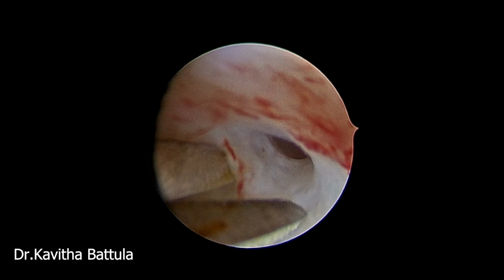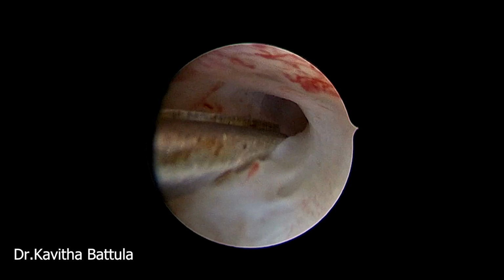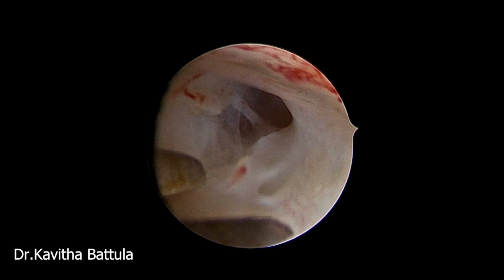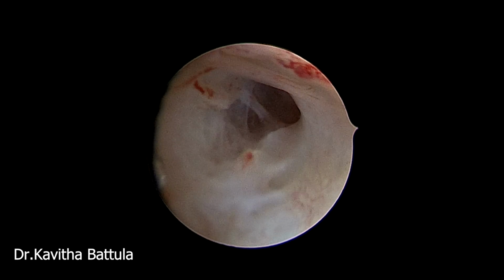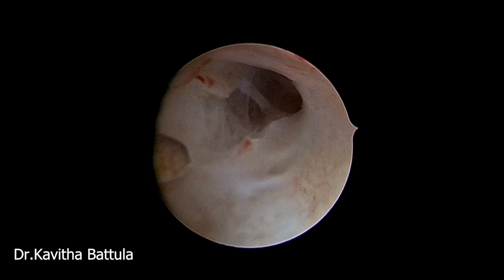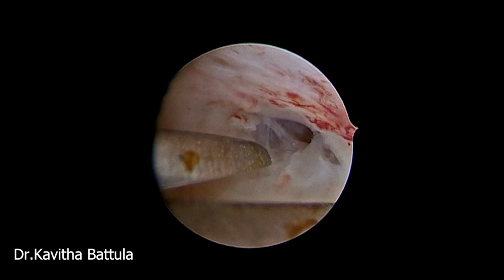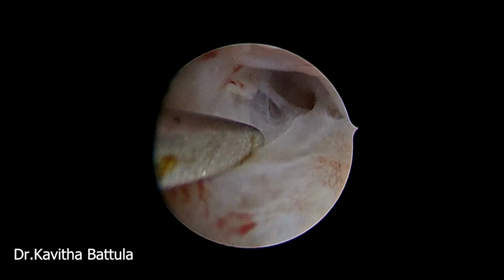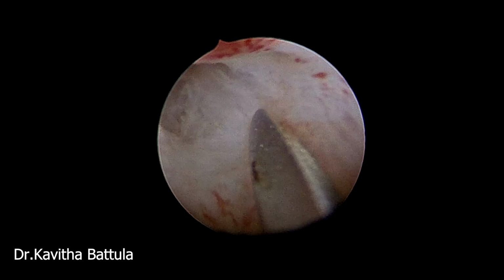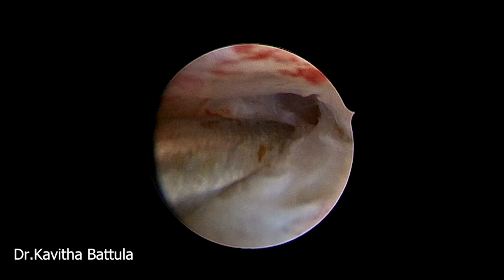So here we cut and we are trying to enlarge the internal os. We are cutting on the other side of the internal os. In postmenopausal women, because the uterus is very atrophic and the cervix also is very atrophic, sometimes the uterine cavity is not aligned with the endocervical canal and internal os. They are at high risk of uterine perforation.